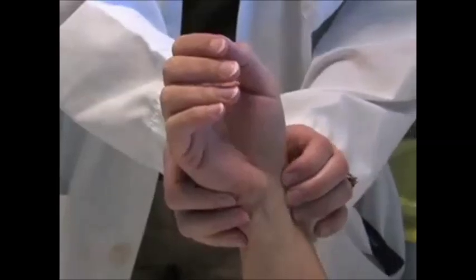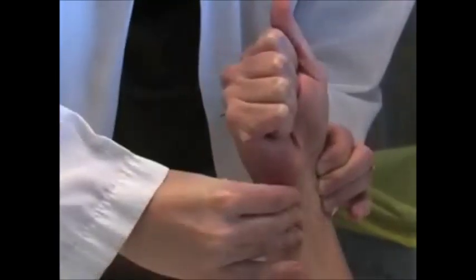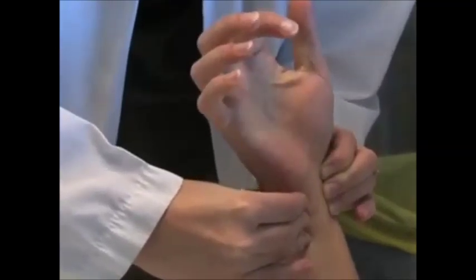To perform the Allen test, occlude both the ulnar and radial arteries. Instruct the patient to make a fist to drain the blood from the hand. This should be done for approximately 30 seconds. Instruct the patient to unclench the fist.